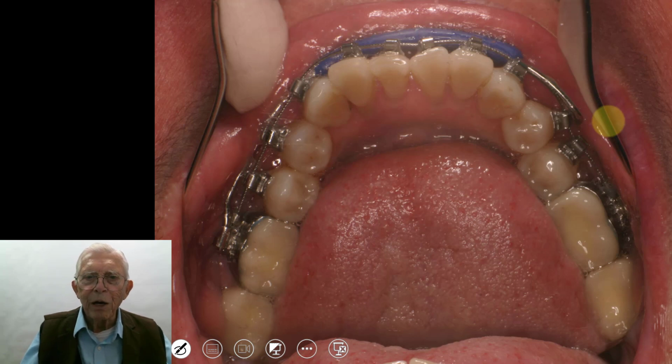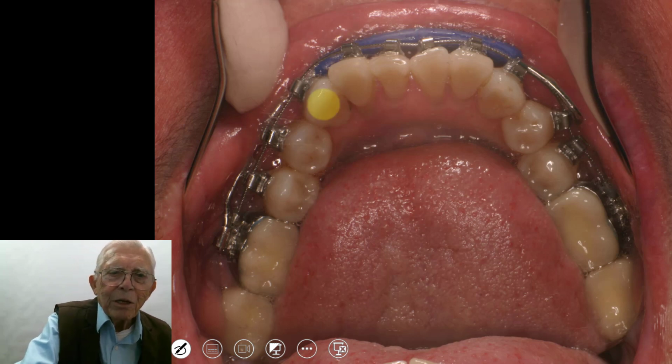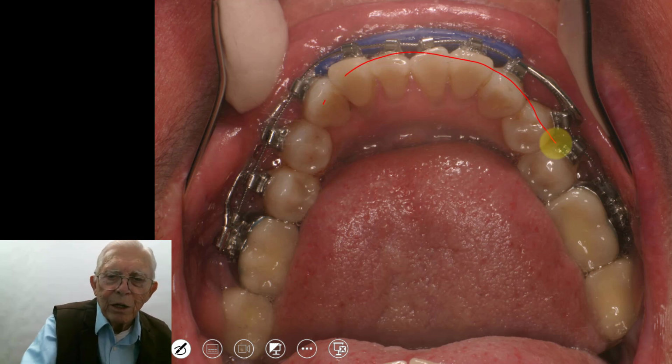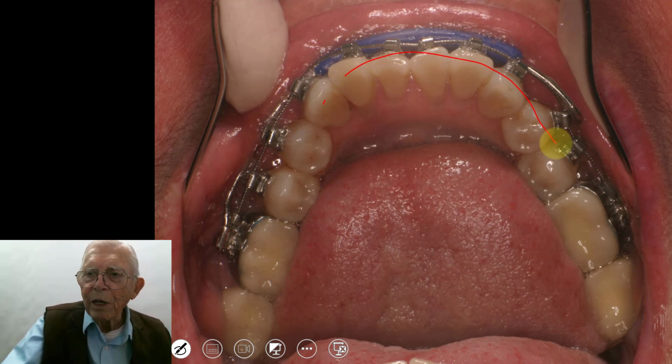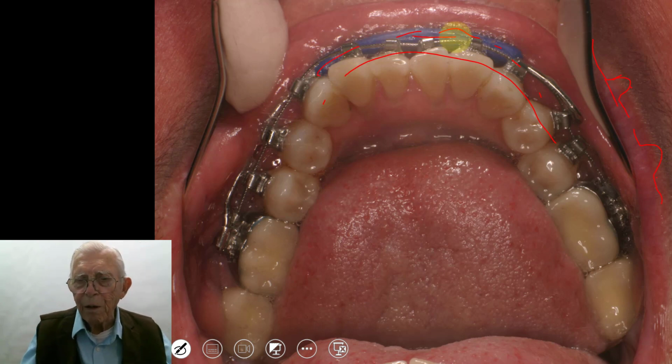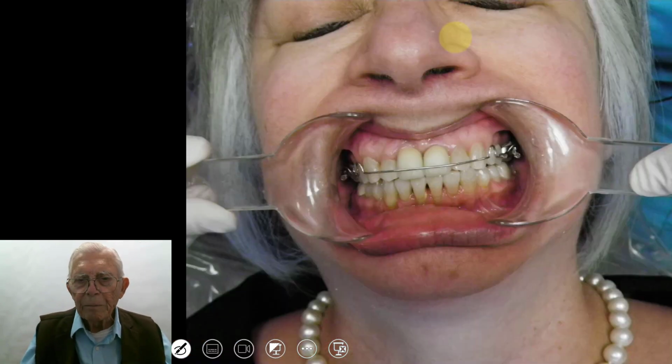So now we've got this out, and these teeth are lined up pretty good. Out here we can expand the lip bumper. You have a kind of a U in the wire, something like that, and you straighten that out to where it's kind of like that. And that pushes the wire forward out here and keeps the lip bumper away from that.